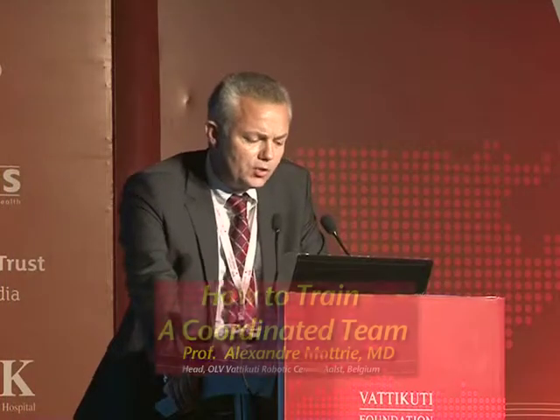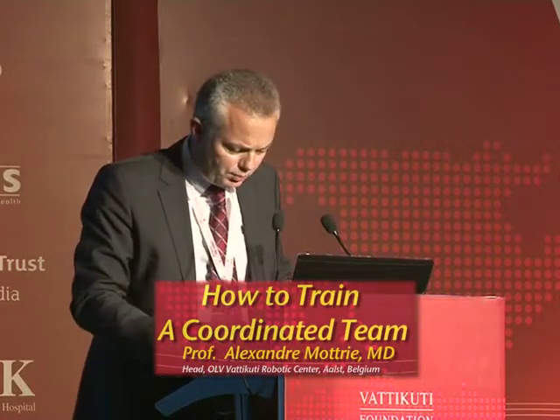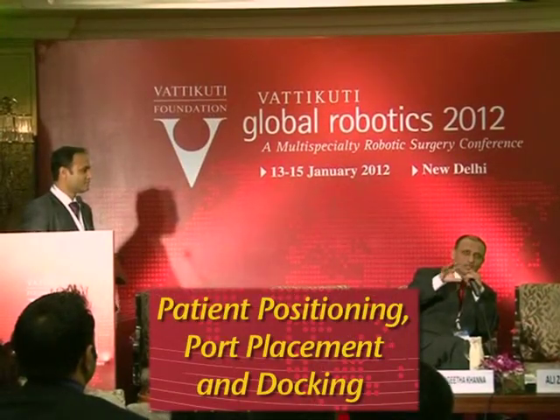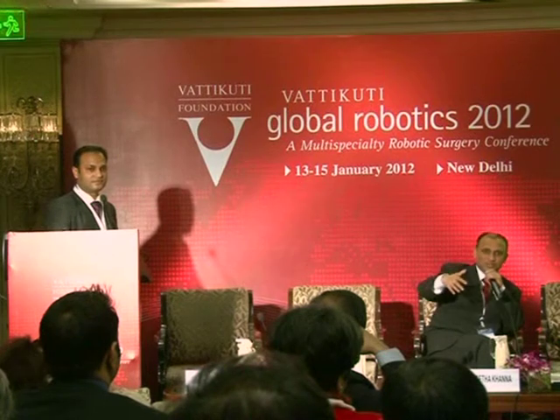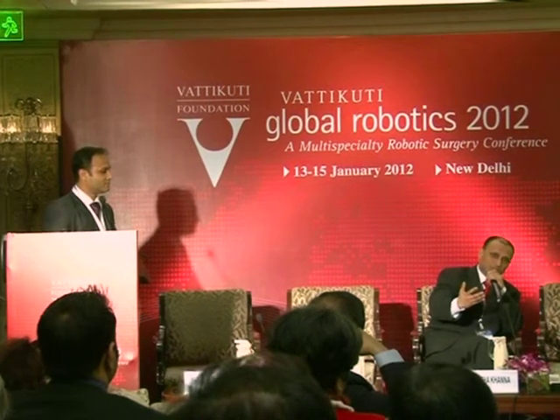The real learning curve is to learn how to do robot-specific surgical procedures. In my practice, what I try to do is keep things standardized. It's really important to do the same thing time and time again. Unless and until I'm struggling, I'll change. But I try to keep things standardized so that when he's setting up the case, I don't have to worry about it. So that's what I do.